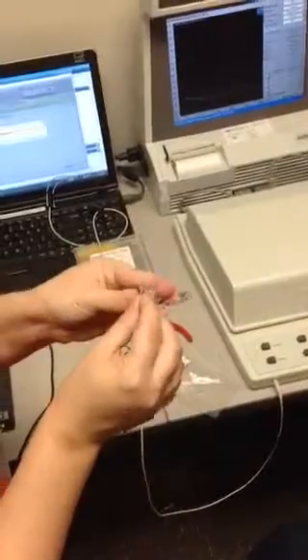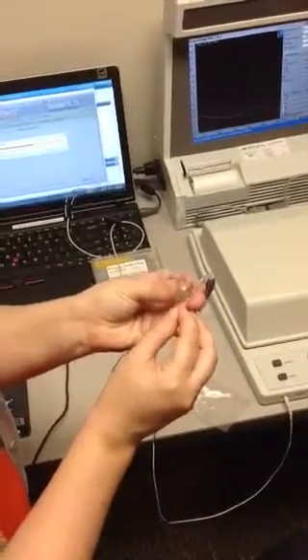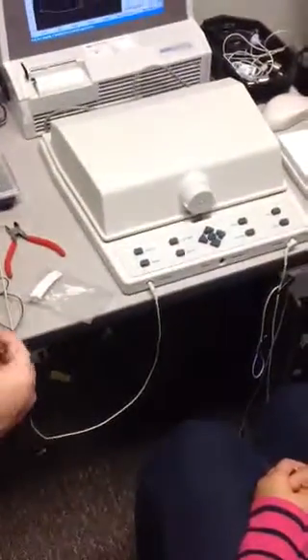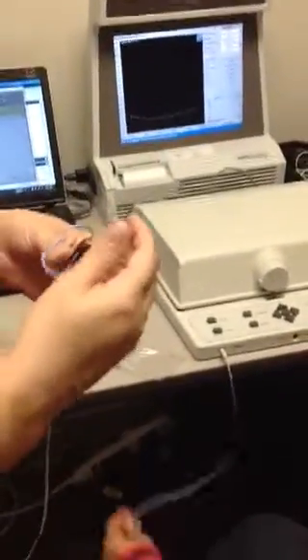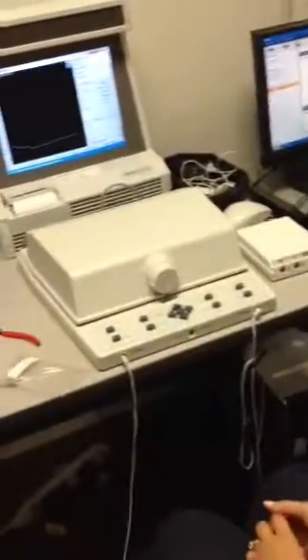Oops, lost my connection. Alright, so now I have the end of it where I want it. So I'm going to attach that to my probe mic housing. Alright, and of course, as we always do, we would do otoscopy first, but today I'm going to trust that Lauren's ears are clear. Ask Aubrey, she usually checks them for me. Okay, and then I want that black indicator right in the intertragal notch there. And then of course we have to reconnect our hearing aid here.